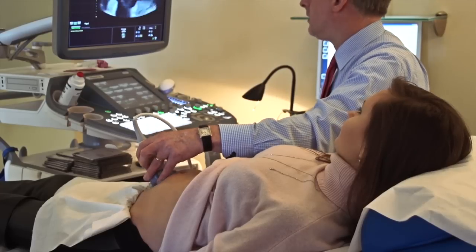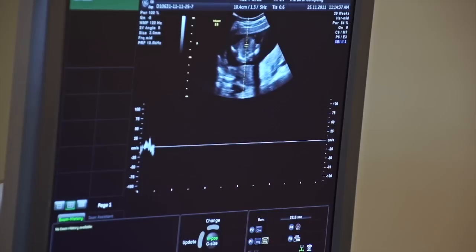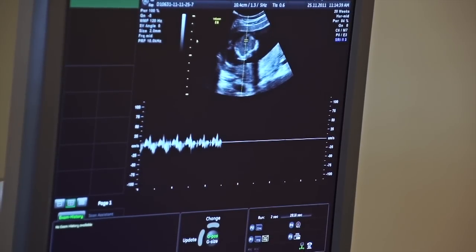Well, we insist that every sexing scan should have a well-being element as well. So we will measure the baby's head, the width of the head, the back to front of the head, the tummy and the leg, look at the amniotic fluid and look at the way the baby is moving. We want to make sure, first and foremost, the baby's okay. And then, of course, we will learn whether it's a boy or a girl.